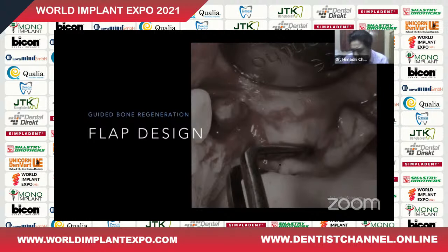Number one, if it is, for example, a lower lingual or any other place where there is a muscle, we can mobilize the muscle and the collagen meshwork of the mucoperiosteum or the periosteum. Because it's cross-linked, we try to break the bonding of the cross-link and thereby create a little bit of mobilization so that we can mobilize the flap. But whatever the technique we are going to talk about, we need to mobilize the flap enough.